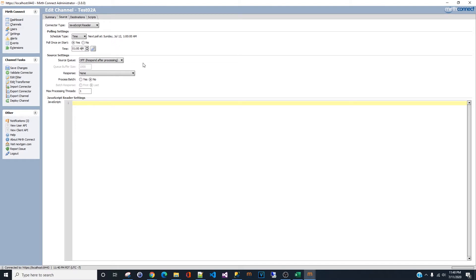If you set Poll Once on Start to yes, once you deploy the channel it will generate the report right at that moment. For this exercise, we want to see if it works immediately — we don't want to wait until 1 o'clock to check for errors. So we're setting it to yes: deploy the channel, is it working? If not, what is the error?